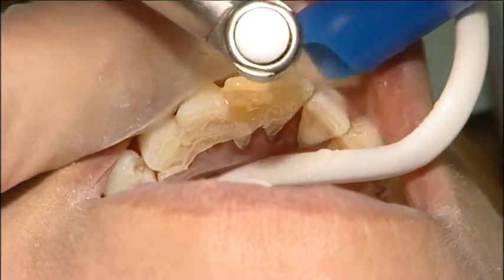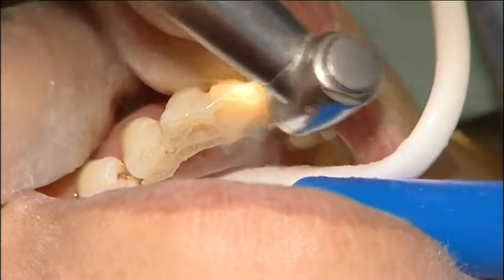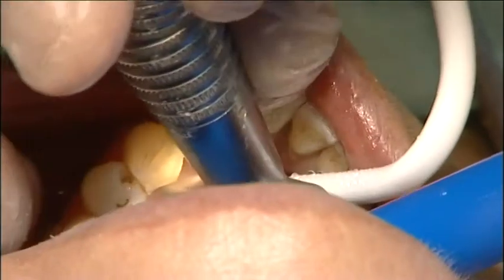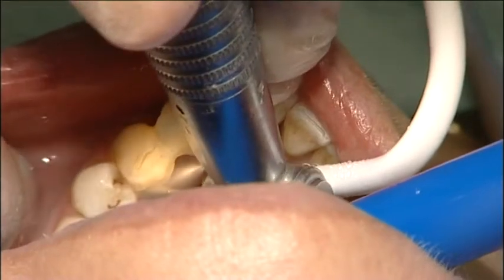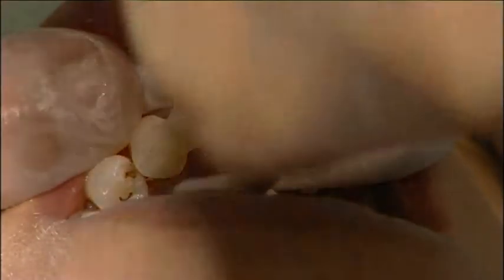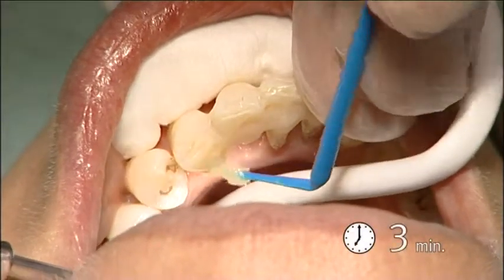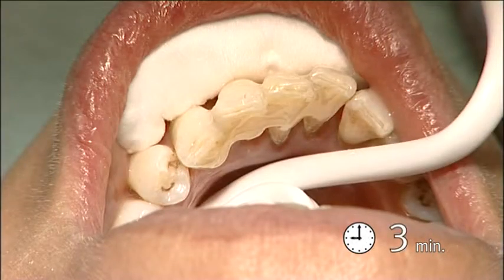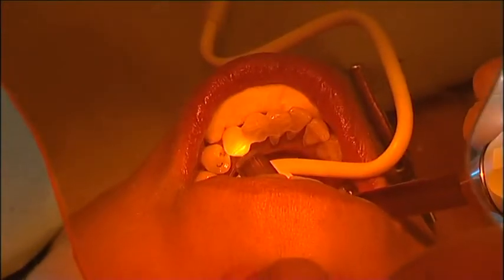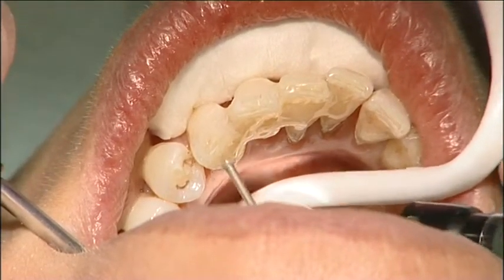The finishing phase was started carefully. The fibre splint was shortened by drilling. Then the exposed fibre surface was reactivated with resin for 3 minutes. The excess resin was removed using air and then light cured. The exposed fibre was then covered with flowable composite and light cured.